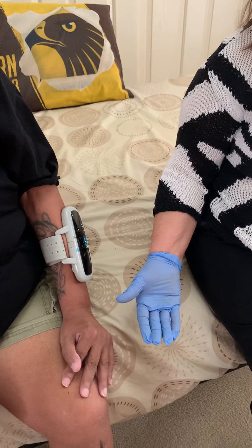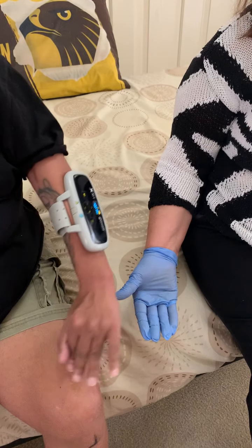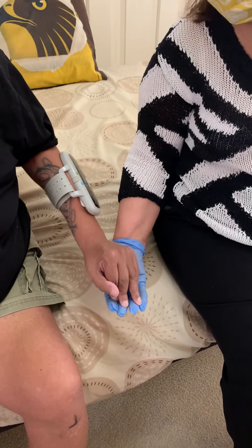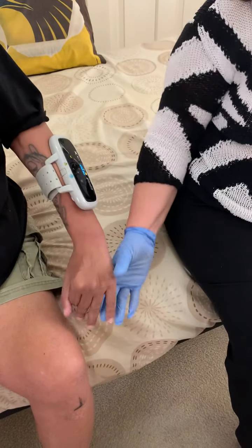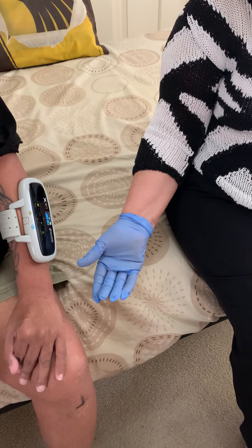I'm going to now lift my hand up and open my hand to touch my carer's hand. Hello. How are you? I'm alright. Give it a bit of a shake. You're shaking my hand. I'm just going to relax and put it back on my leg.